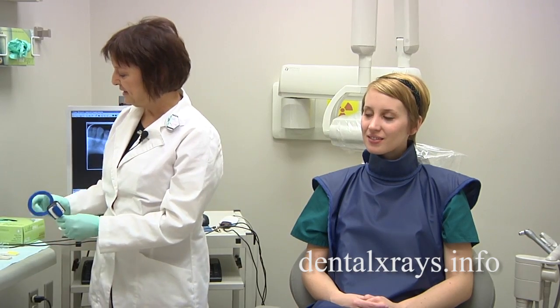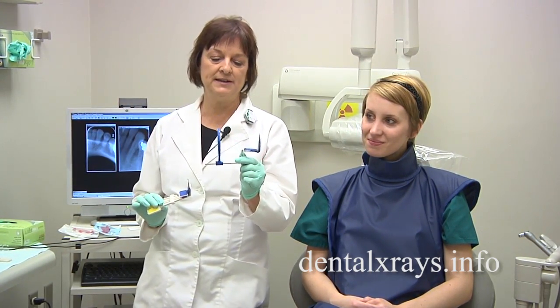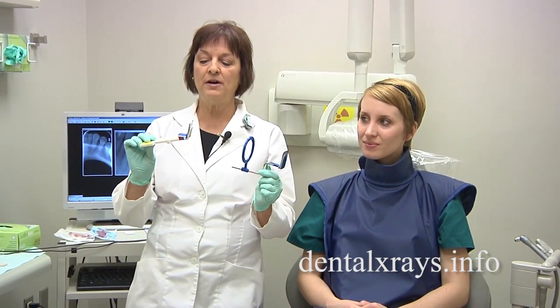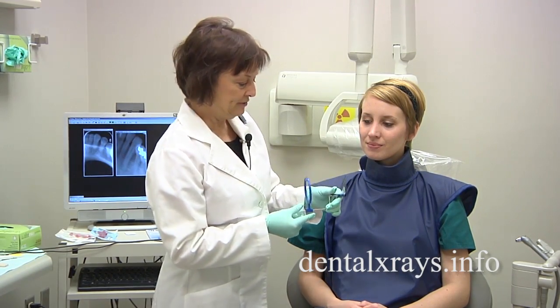There are different pieces that you may want to use. Some offices always use the Rennon's instruments — they're great. Or some offices use the bisecting angle technique. I'll start with the ring and show you how to do a few anteriors.